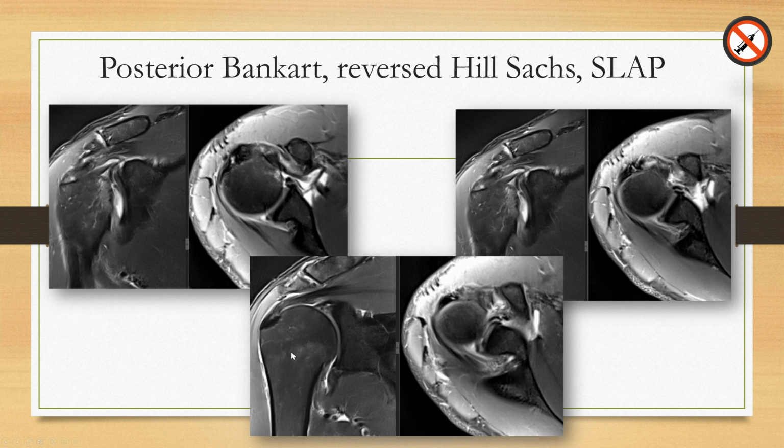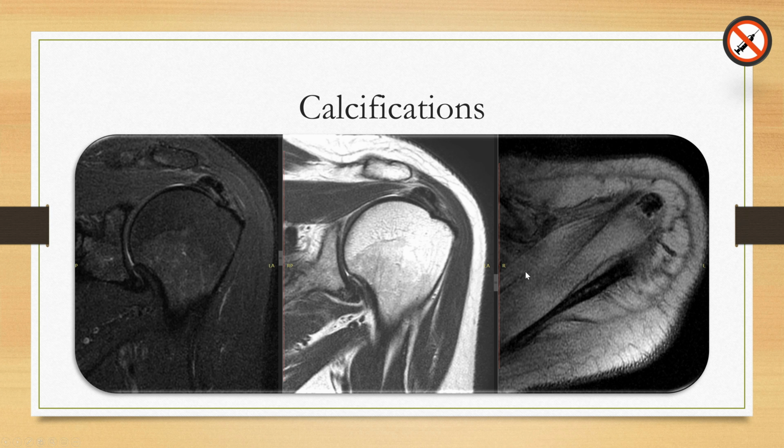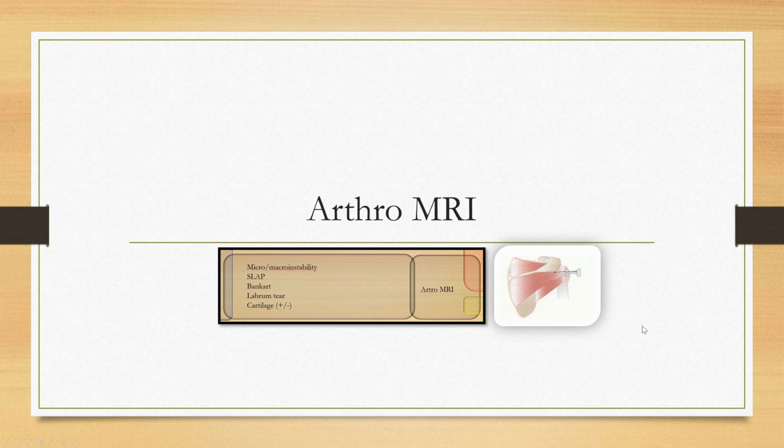You don't need contrast for calcification. You see calcification very well here because they are huge. If they are small, they are more difficult to see, but the ultrasound would perform better. But nevertheless, you don't give contrast for calcification.